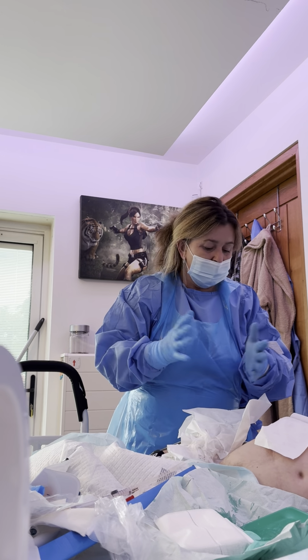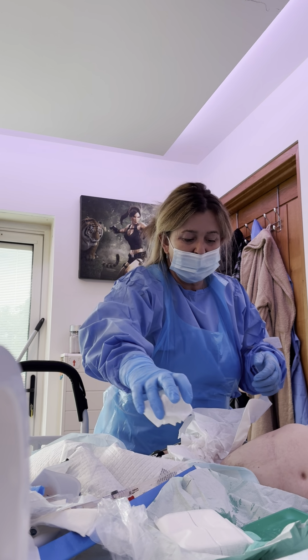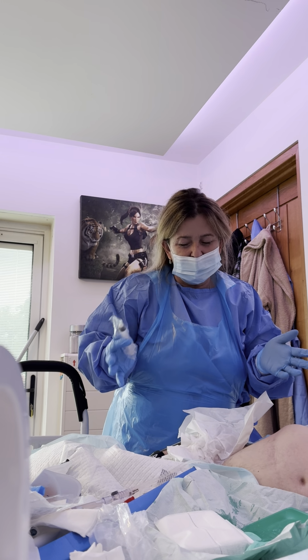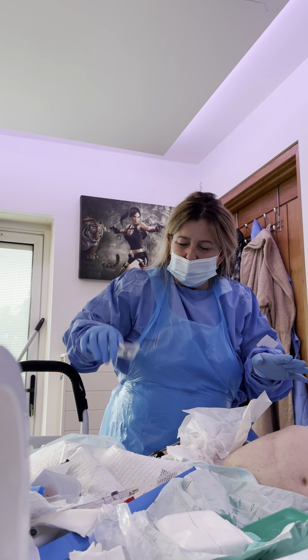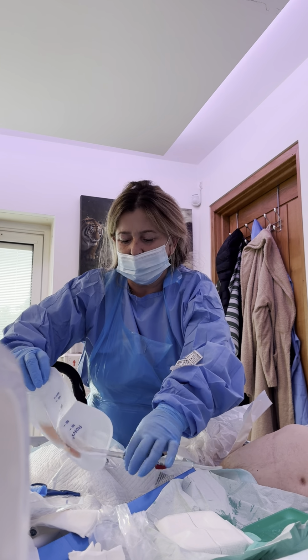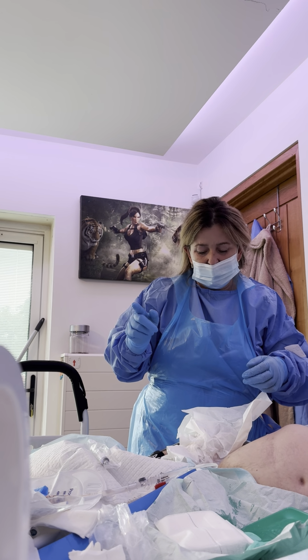Don't tug it hard, love. I haven't tugged it hard, no. Have I ever tugged it in 26 years? So yeah, I do have extra syringes just in case it ever fails. And what I'll do is I'll just show you this little bit of blood that's come out. And it would be because of that catheter. And I'm going to show you the balloon.